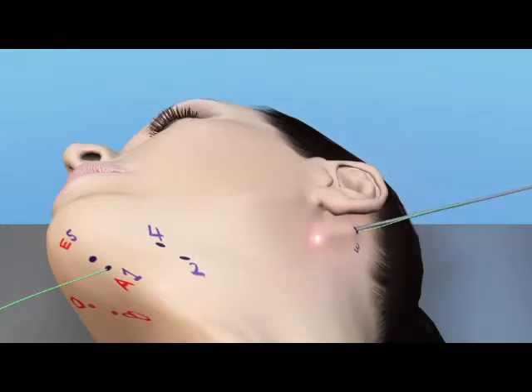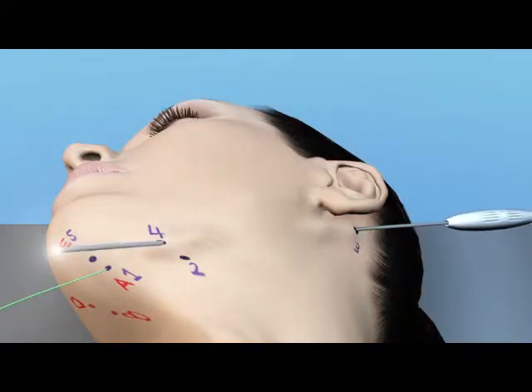The rod is then brought up so that it will encircle the ligamentous attachments in the mastoid area, and then directed downward to point 4, where it is brought out.